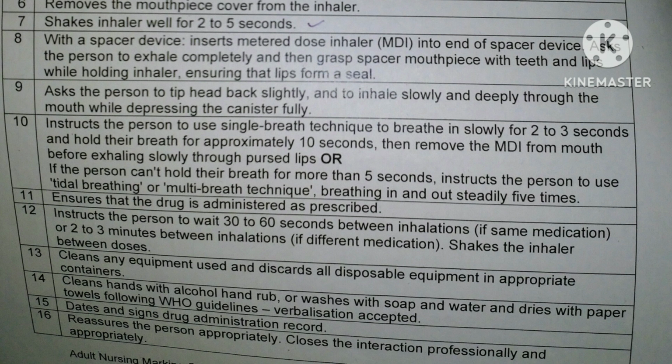So we should ask them, are you able to hold your breath for more than 5 seconds? If they say they can, we explain the single breath technique. Ask them to breathe in slowly for 2 to 3 seconds and hold their breath for approximately 10 seconds, then remove the spacer from the mouth before exhaling slowly through pursed lips.